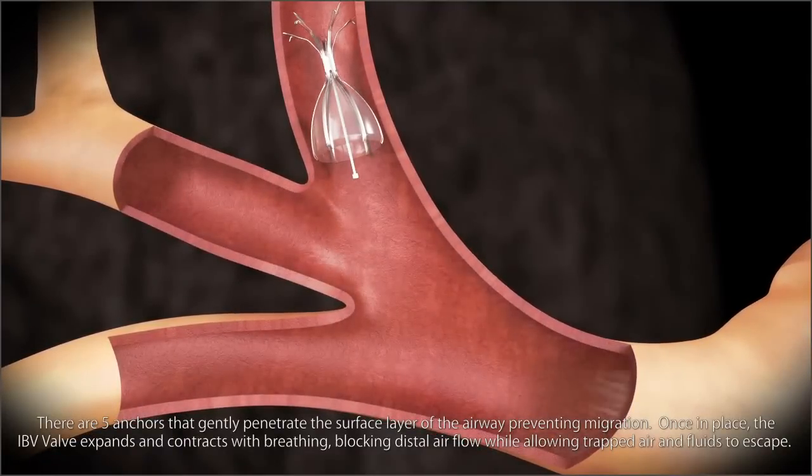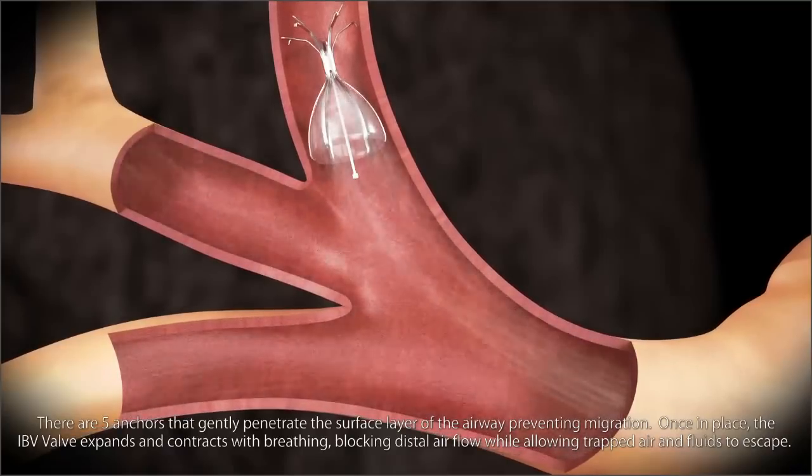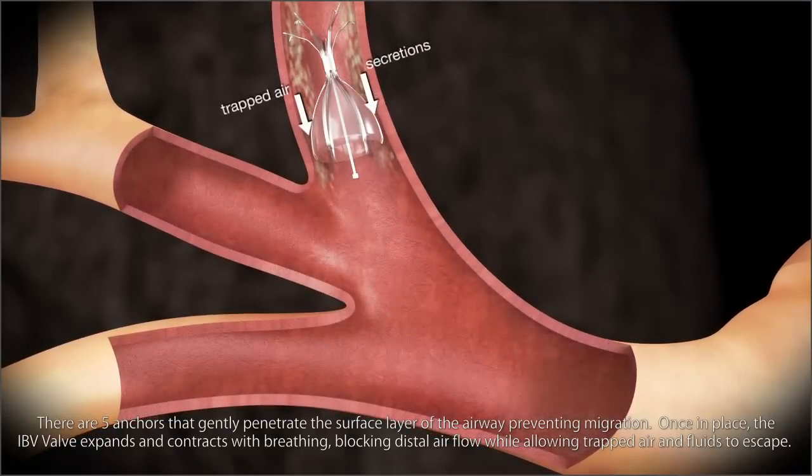Once in place, the IBV valve expands and contracts with breathing, blocking distal air flow while allowing trapped air and fluids to escape.